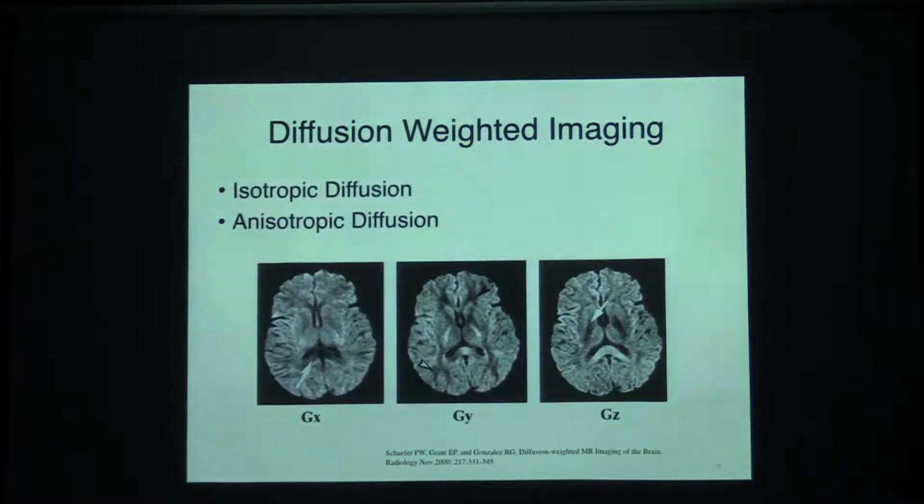And again, this is all just background until we get into your diffusion tensor stuff. So you're taking 3 different gradient directions, right? And there's 2 concepts here. One is called isotropic diffusion, and the other is called anisotropic diffusion. In isotropic diffusion, like I mentioned before, this is what Einstein described: water molecules are randomly moving in an unrestricted medium, so it's going to spread out into a sphere.